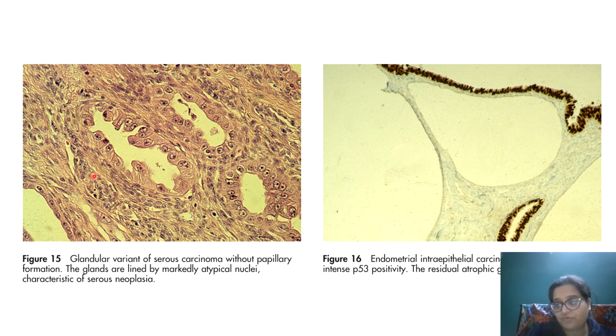This tumor is more of an older age tumor, and hence they have done a P53 IHC, where the atrophic residual glands are not showing it, the tumor might be showing it. So see, P16 and P53. P53 wild type and P53 mutated. We have to see whether the expression in both P16 and P53 is continuous or heterogeneous. Heterogeneous means normal. Continuous or loss sometimes means malignancy. Since these are normal markers of the body, you and I have P53, P16 also, their mutation will lead to some sort of change in their expression, either loss or too strong an expression. Otherwise they are heterogeneously present.